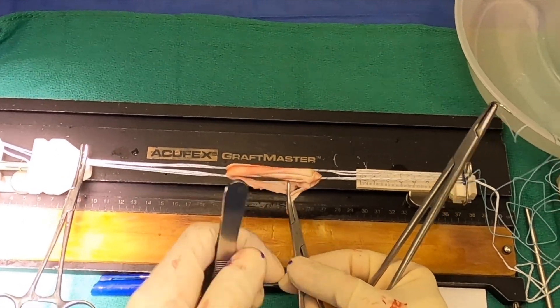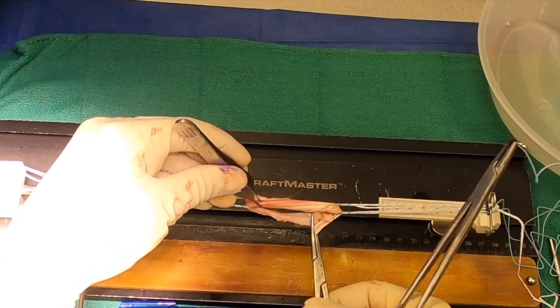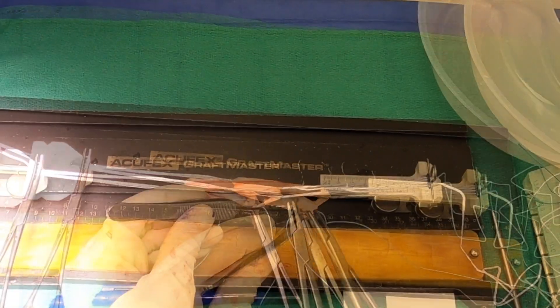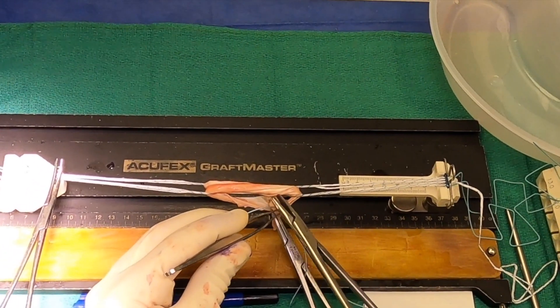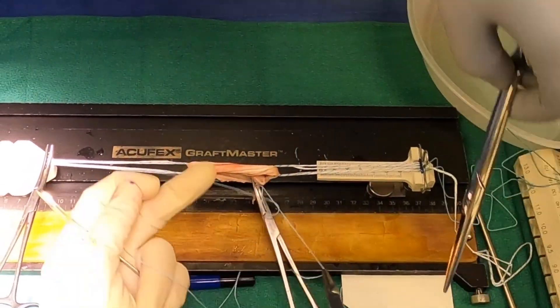We've looped the graft around to make four strands and snapped the ends, sliding the snapped ends toward the femoral button. I've made a crude drawing, but the yellow represents the graft — you can see we loop it around until there are four strands with the ends meeting near the femoral side. I then stitch those together with a simple whip stitch, tie that off, and trim any dog ears that are left over.